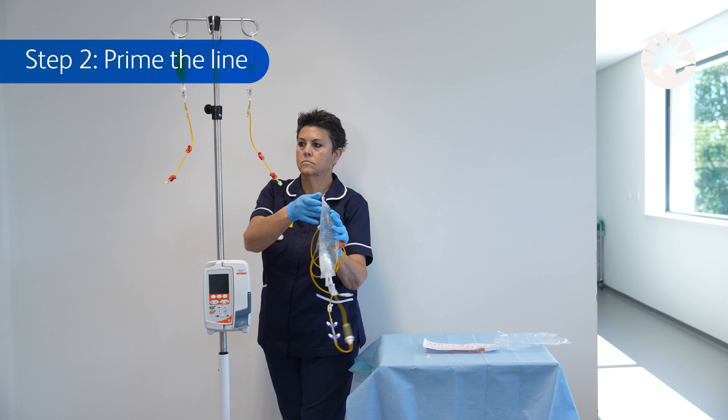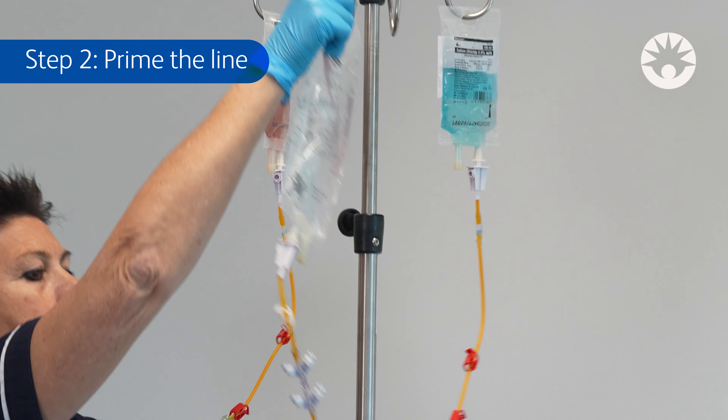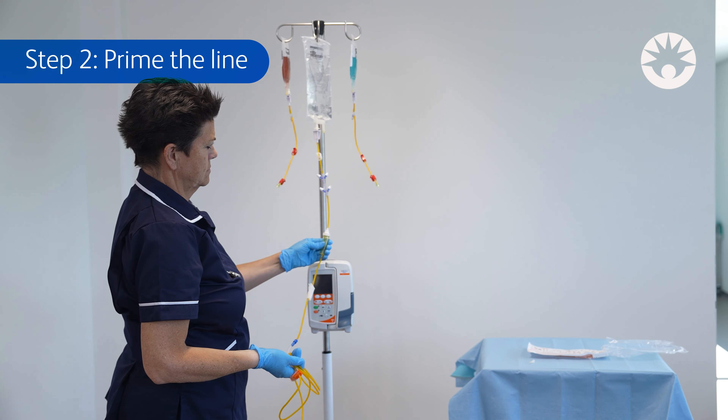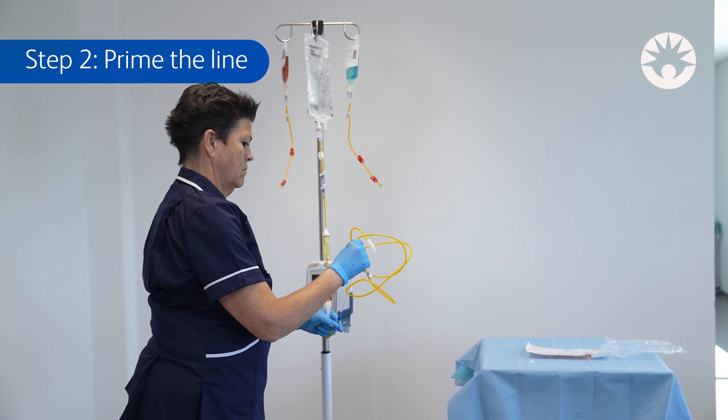Step 2: Prime the line. Hang the fluid container onto the IV pole. Open the pinch clamp and gently prime the drip chamber until it's half full. Open the roller and lower pinch clamp to prime the set.